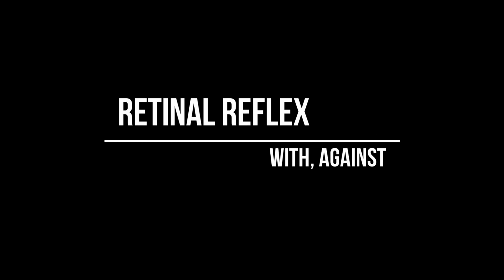Always use the right eye to examine the patient's right eye and then the left to examine the patient's left eye. And then start off by sweeping the patient's eye with a beam of light from the retinoscope and observe the light that comes out of the eye. As you sweep across or up and down, determine if the motion is with or against in each meridian. It could be a vertical meridian, horizontal, or oblique, just as necessary. Remember, the two principal meridians are separated by 90 degrees.